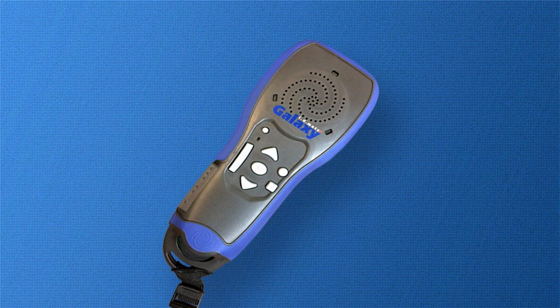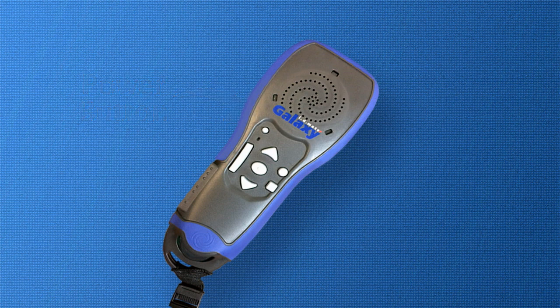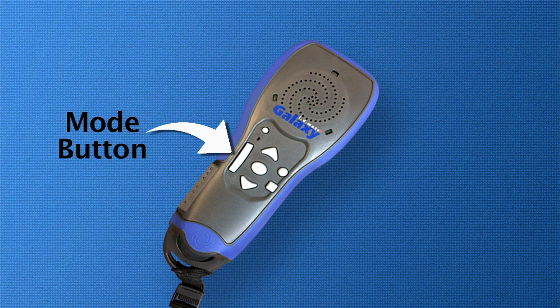On top of the device, starting on the left side, there is a circular button. This is your power button. Underneath this button, there is a vertical rectangular button, which is your mode button.